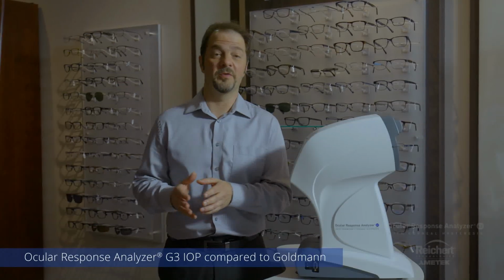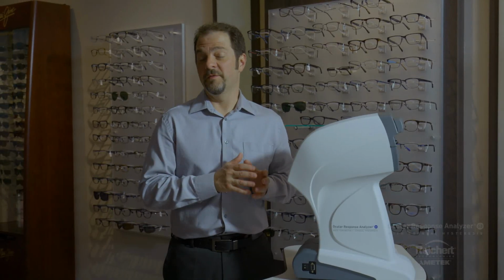One of the questions we get asked frequently is, why does the IOP value from this device differ from the IOP I'm getting on my Goldmann tonometer or my other method of tonometry? So let's talk about that for a moment. The IOP-CC measurement, if you recall, is specifically designed to be less dependent on corneal properties, so it's reasonable to expect that that pressure measurement might read differently from Goldmann in a large percentage of cases.